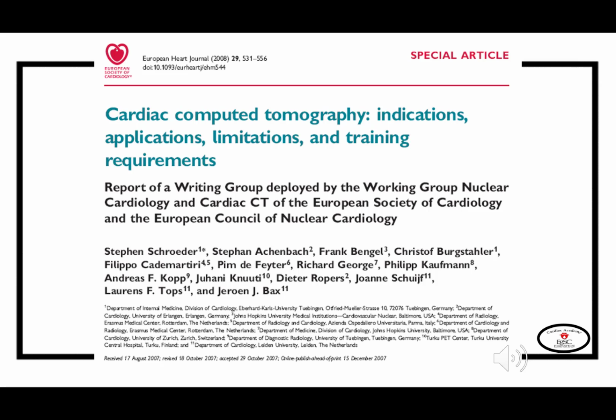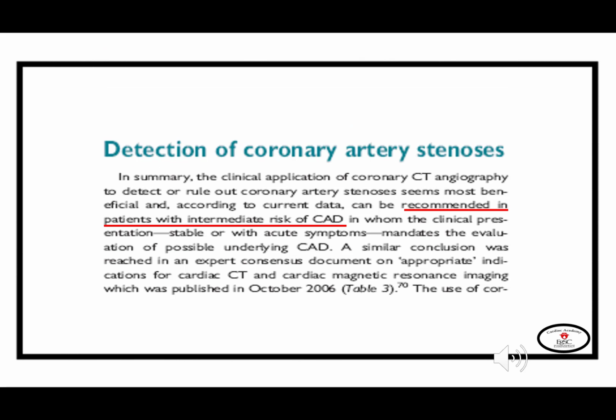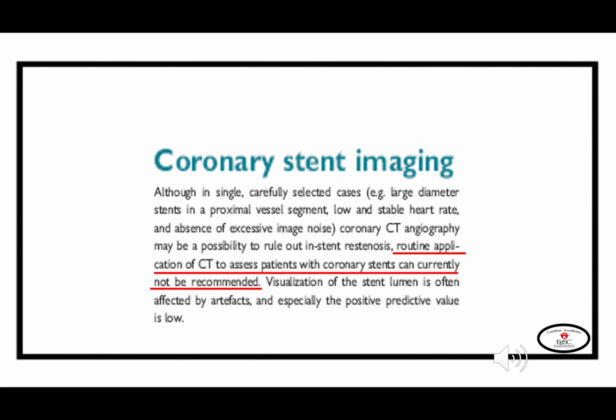And the European Society of Cardiology also issued this paper regarding the indications, applications, limitations, and training requirements for cardiac computed tomography. To summarize their recommendations, in detection of coronary artery stenosis, it is recommended in patients with intermediate risk of coronary artery disease. As for stent imaging, its routine application cannot be recommended.